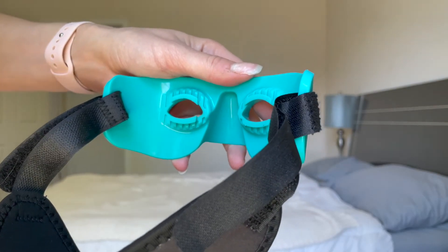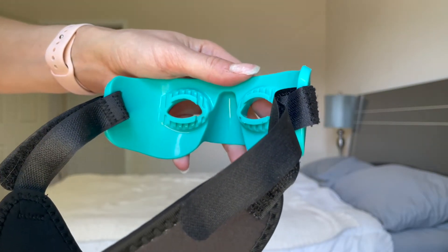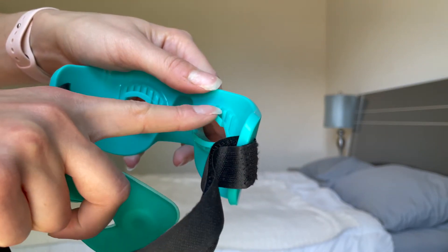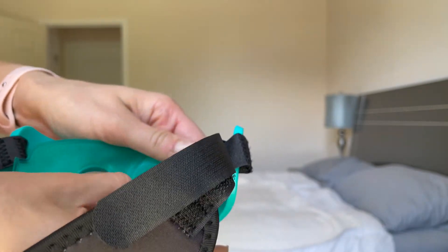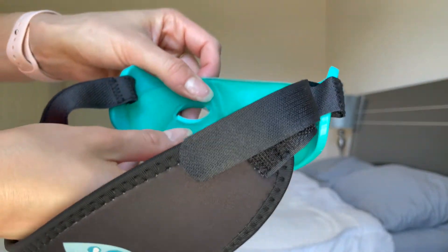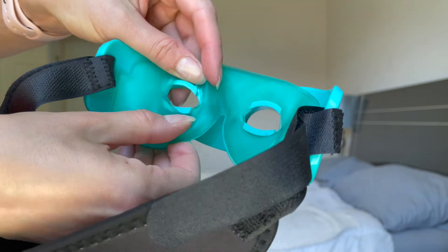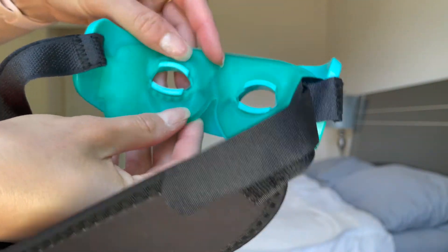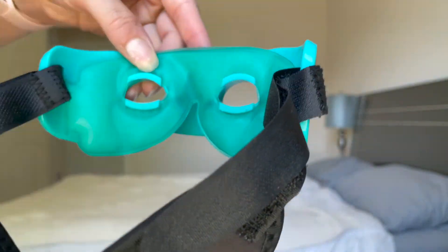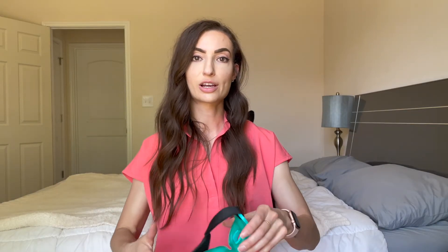Once the gel pack is heated up, you'll go ahead and snap it inside of the hard covering. There are little ridges around the eye holes that you can hook the gel pack to. Once it's on, you are ready to go. Wear it for about 10 to 15 minutes.